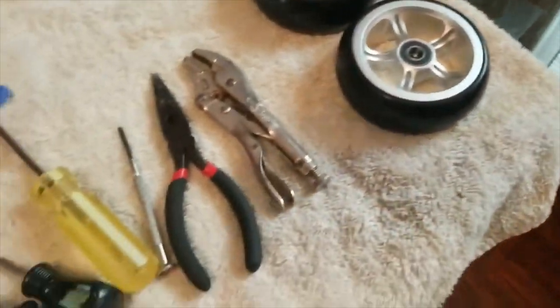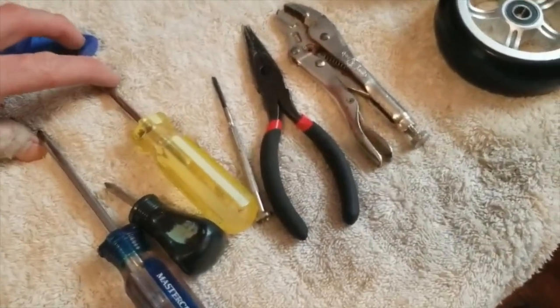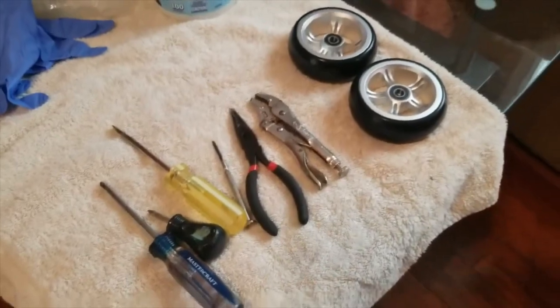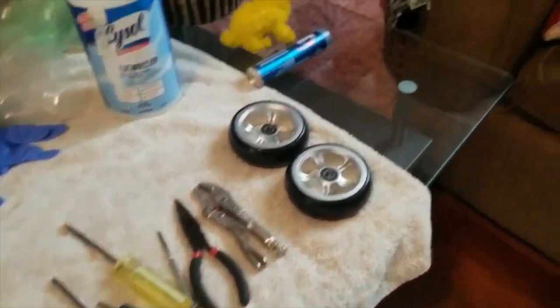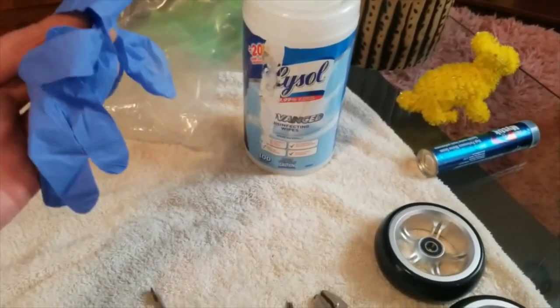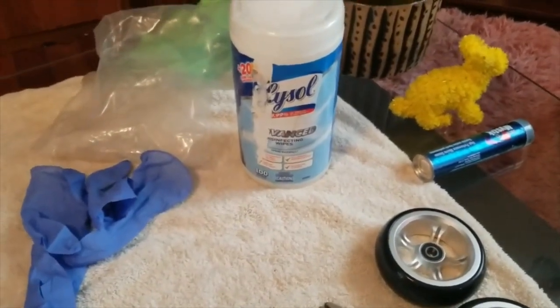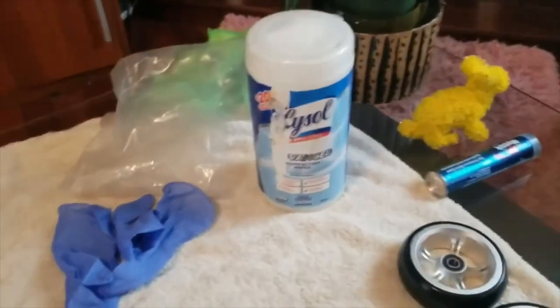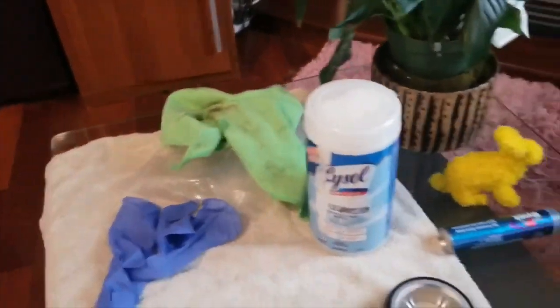Generally, all you need is the two Phillips screwdrivers and hopefully today's replacement will go smooth and that's all we need. I also have a pair of gloves because you're going to get really dirty — you want to protect your hands. I have some Lysol wipes to clean the forks, and I just have an extra rag in case I need to wipe something down.